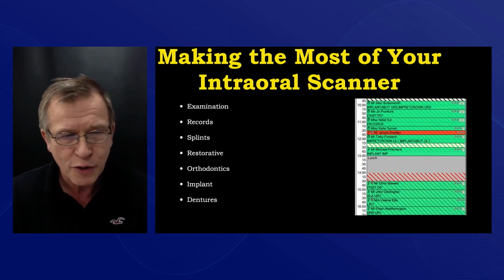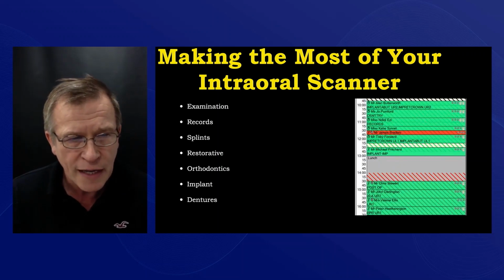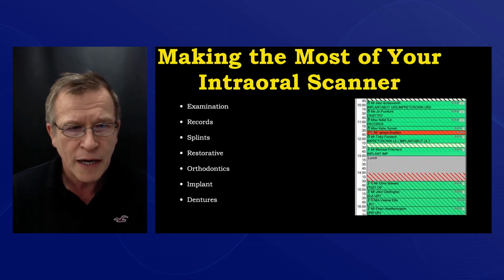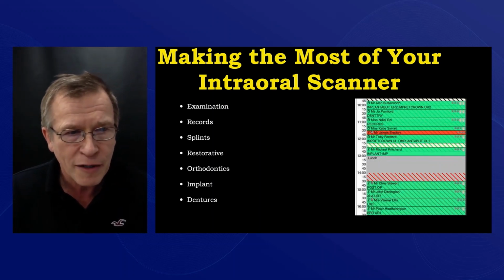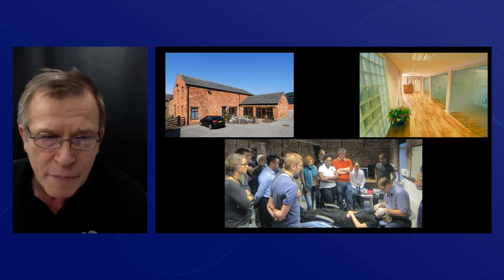It used to be not a dread of mine, but it was always a difficult thing, trying to take impressions around implants. Now with scan bodies and digital impressioning, it really becomes so much easier to do. And then just briefly, we'll mention a little bit about dentures. Dentures is not a main part of my practice, although now with digital dentures coming on the horizon and the success that some of my colleagues are having with that may well be something that we start to revisit a little bit more.